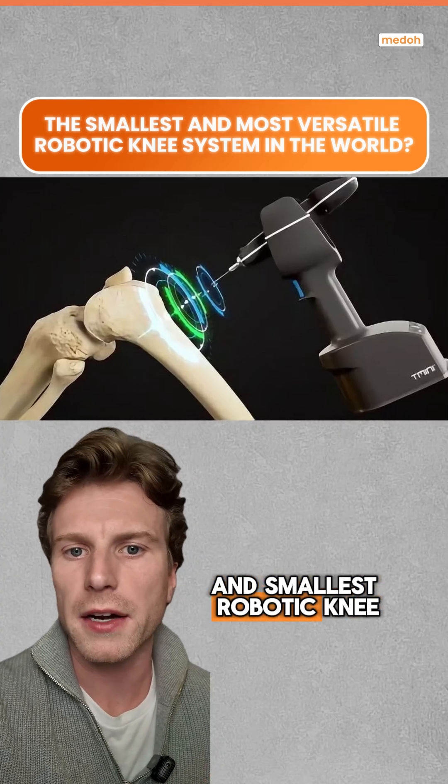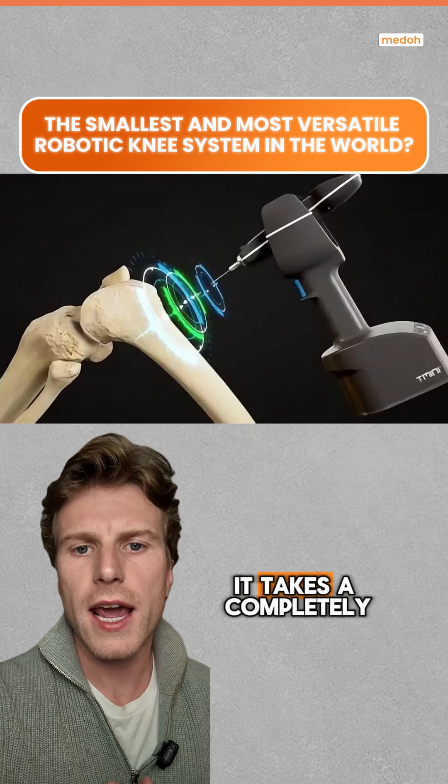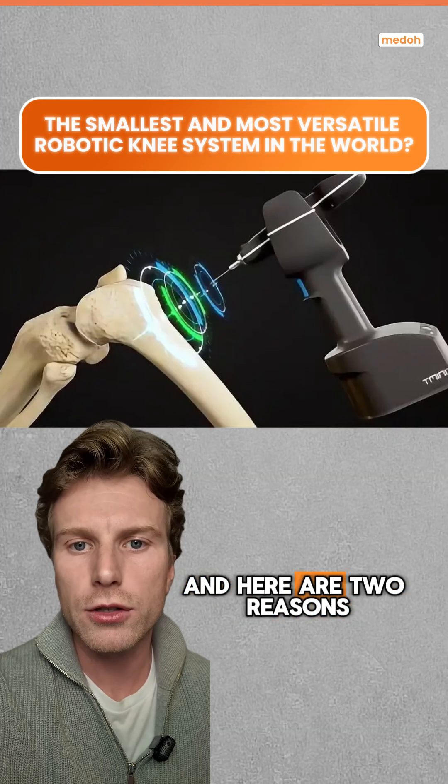Is this the most versatile and smallest robotic knee replacement on the market? This is called the T-Mini from Think Surgical. It takes a completely different approach when it comes to robotic knee replacement compared to its competitors, and here are two reasons.